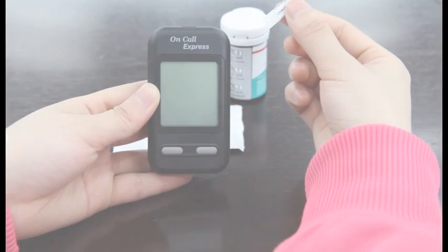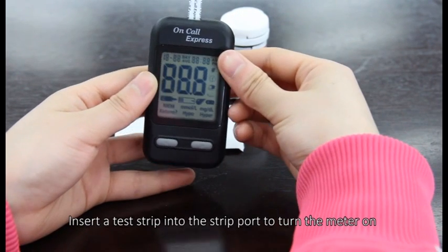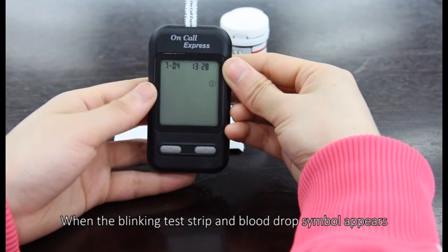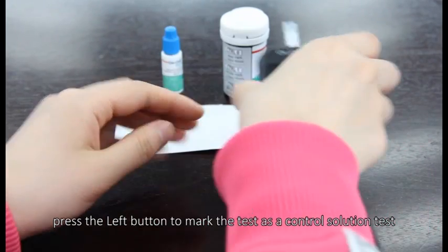Performing a quality control test. Insert a test strip into the strip port to turn the meter on and check the display. When the blinking test strip and blood drop symbol appears, press the left button to mark the test as a control solution test.